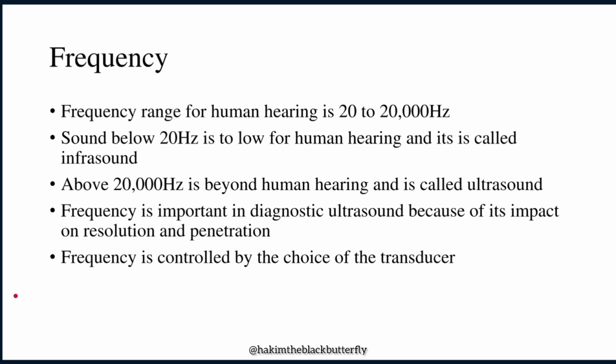By the way, what I didn't tell you is that the frequency we use for diagnostic purposes ranges between 1 megahertz to 20 megahertz. Much as I said that sound with frequency beyond 20 kilohertz is ultrasound, not every frequency above 20 kilohertz can be used for diagnostic purposes. No. The frequency we use for diagnostic purposes has a range that is 1 to 20 megahertz.